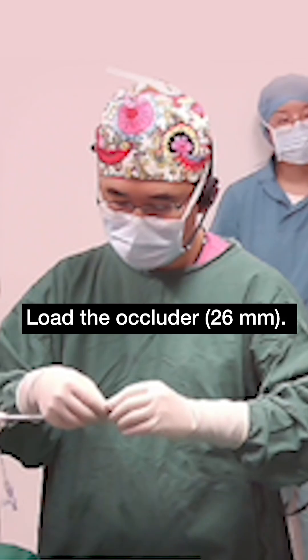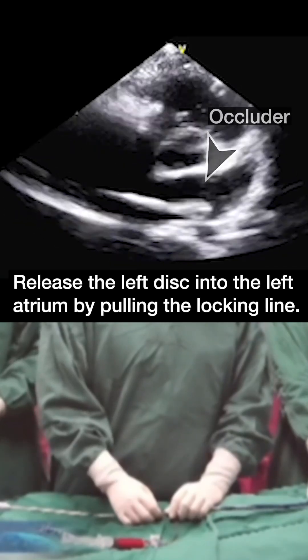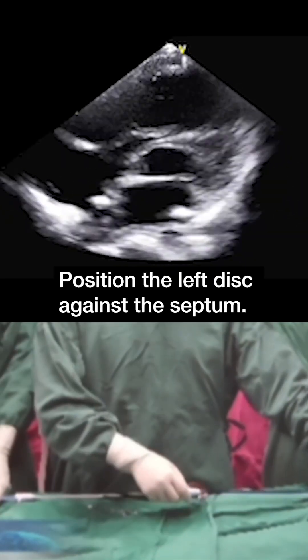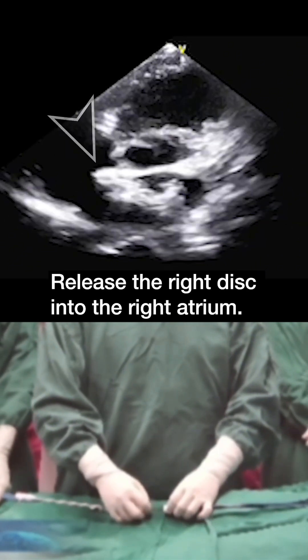Load the occluder and deliver it to the left atrium. Release the left disc into the left atrium by pulling the locking line. Position the left disc against the septum. Release the right disc into the right atrium.